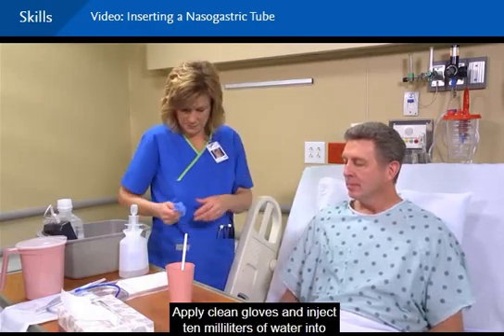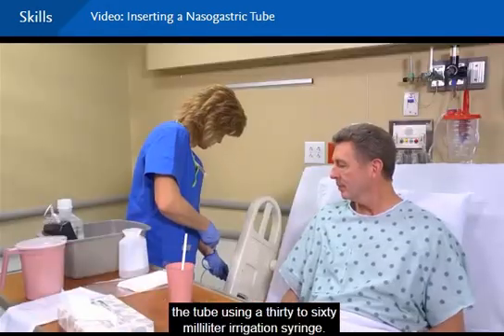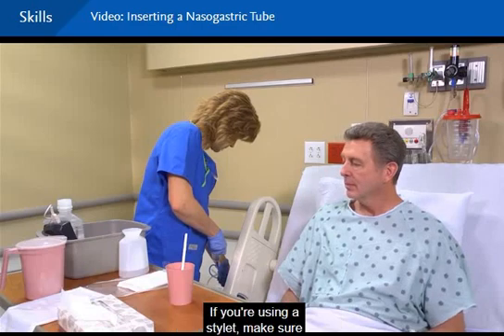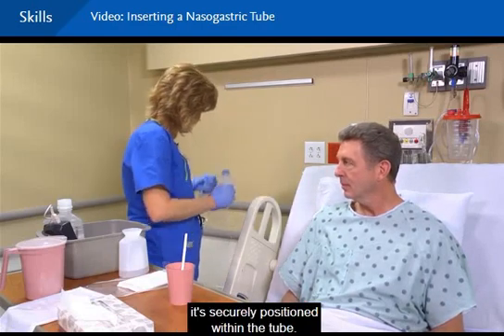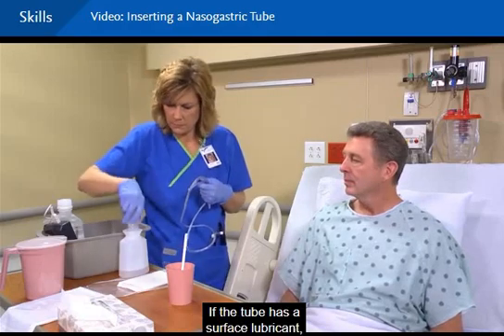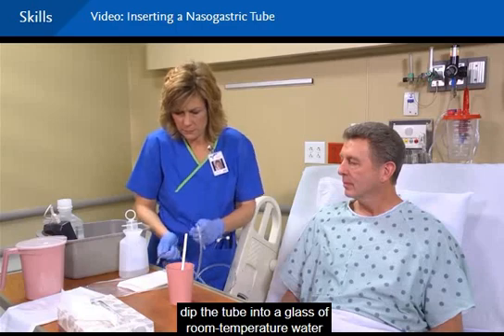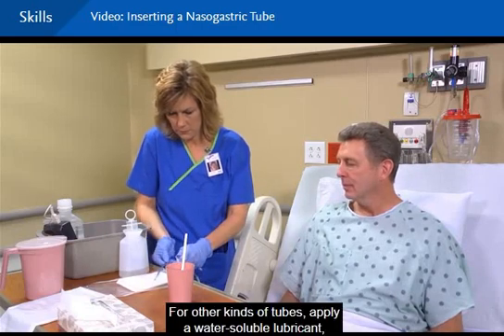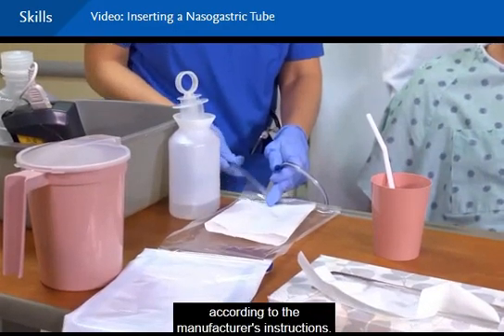Apply clean gloves and inject 10 milliliters of water into the tube using a 30 to 60 milliliter irrigation syringe. If you're using a stylet, make sure it's securely positioned within the tube. If the tube has a surface lubricant, dip the tube into a glass of room temperature water to activate it. For other kinds of tubes, apply a water-soluble lubricant according to the manufacturer's instructions.